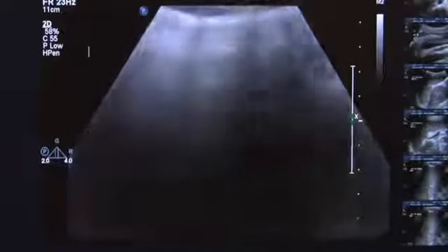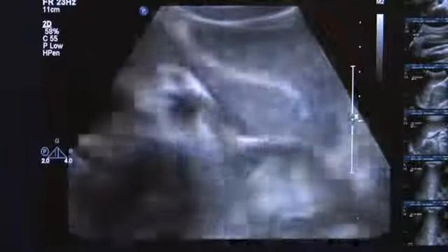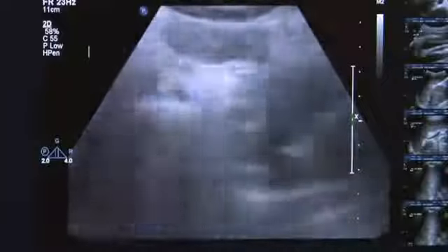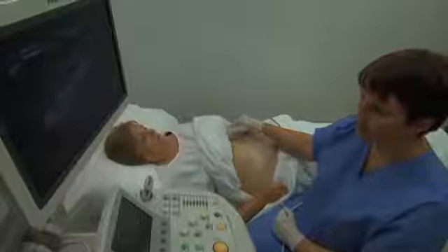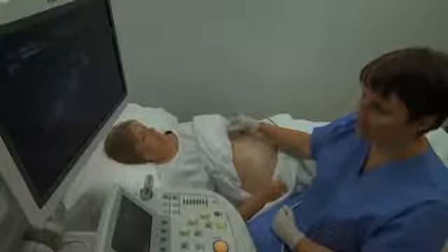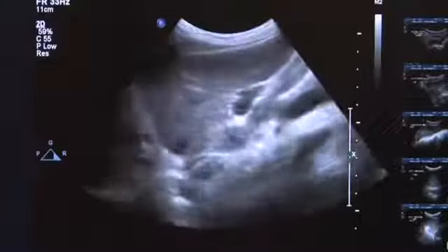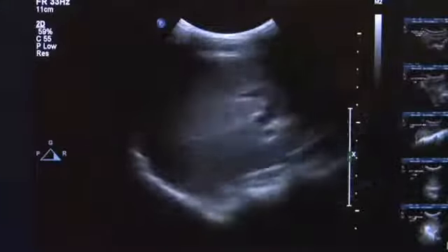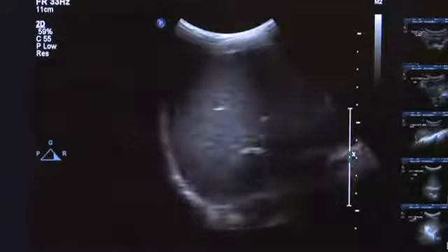There are no set positions for imaging of the retroperitoneum and peritoneal cavity. Images are taken if there is pathology. The areas that should be scanned include the following: the right upper quadrant, the left upper quadrant, the midline, and the pelvis. When examining the retroperitoneum, keep in mind that it is the potential spaces that are being evaluated. Assess each potential space in both the transverse and longitudinal planes.